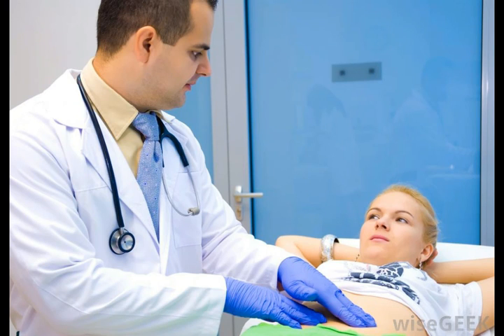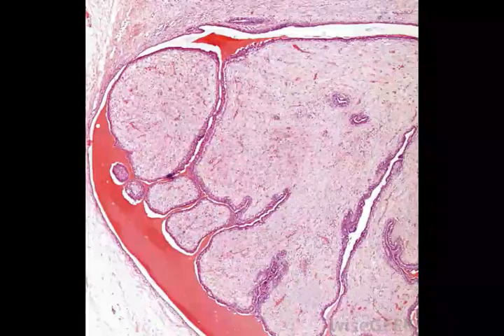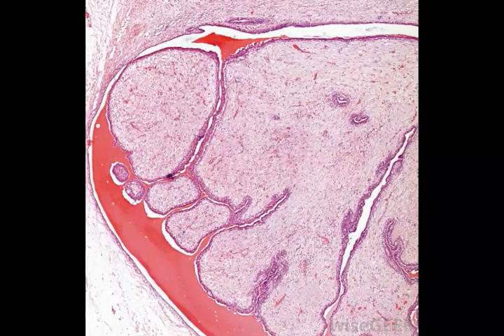A hypoechoic breast mass may be benign, as in the case of a non-cancerous tumor called a fibroadenoma. This appears on an ultrasound scan as a hypoechoic mass with smooth edges. Fibroadenomas are common in young women and may sometimes disappear by themselves, so they are usually only removed if they are large or increasing in size.